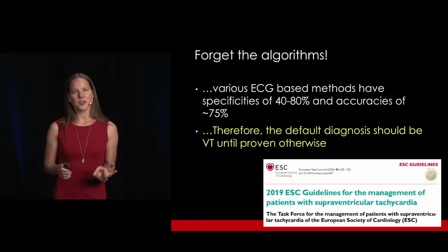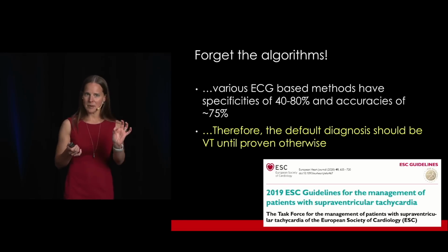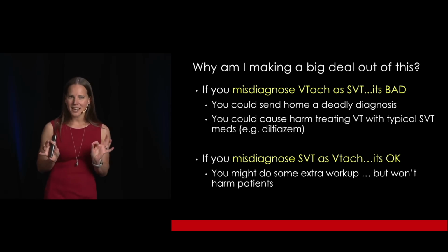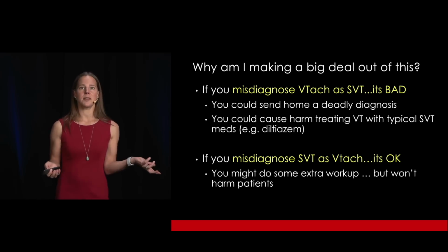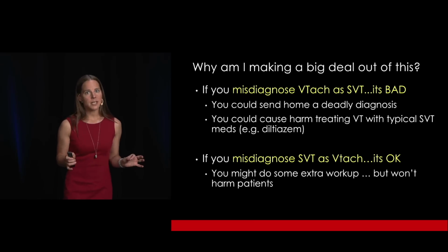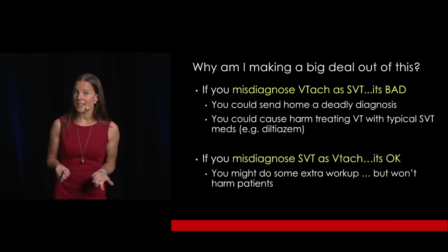So forget the algorithms. You can safely assume that a wide complex tachycardia that's not ischemia, hyperkalemia, or drugs is VTAC. Now, why am I making a big deal out of this? Well, it's because if you misdiagnose VTAC as SVT, it's bad. You could send home somebody with a deadly diagnosis, and treatment for SVT is different. If you give somebody with a VTAC typical SVT meds, like diltiazem, for example, you can really make things worse.